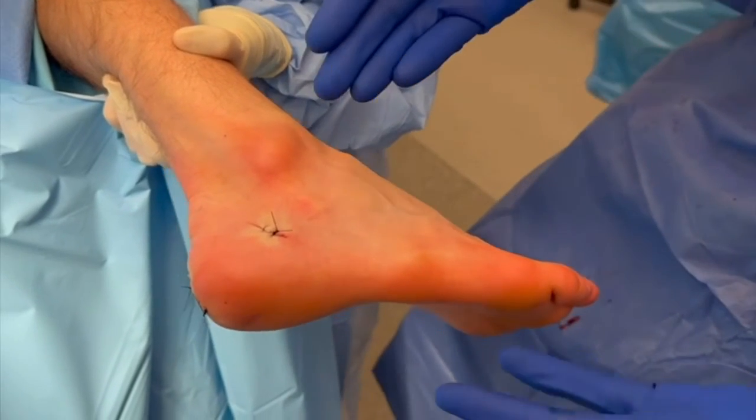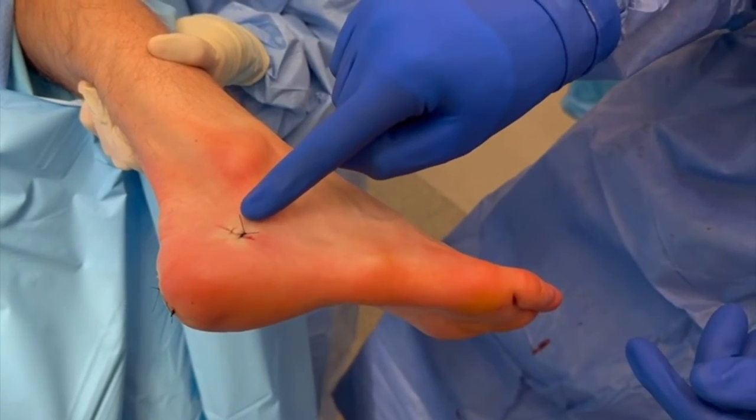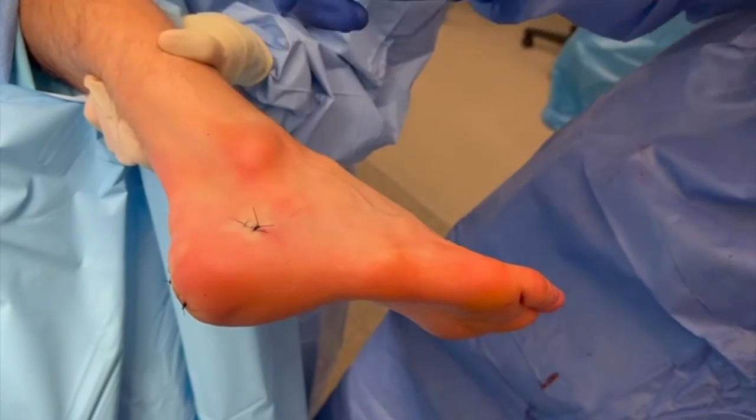You can see our closure here: one small incision for the osteotomy, and two small incisions for the 7 millimeter screws.